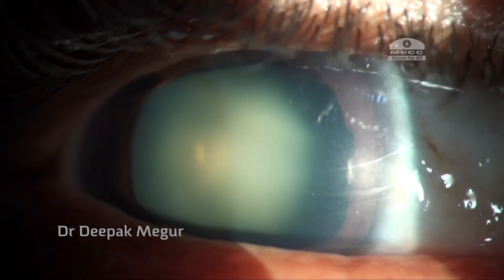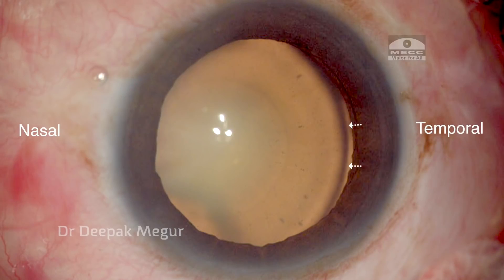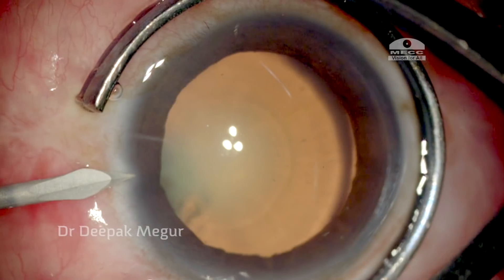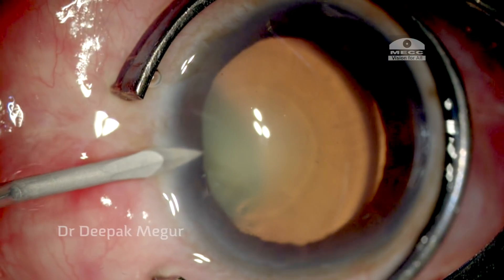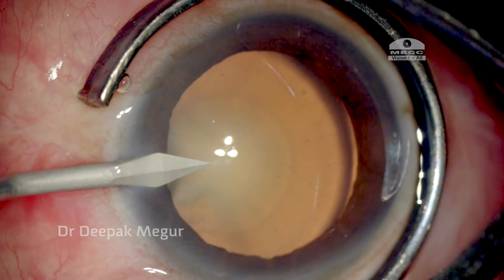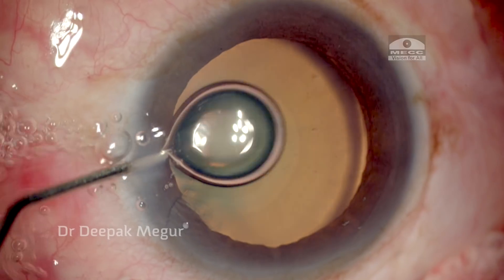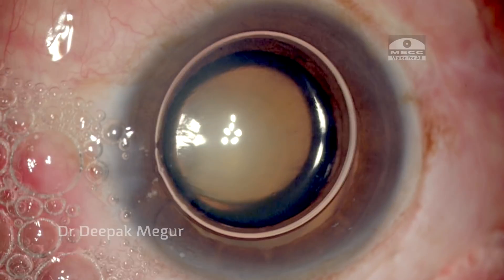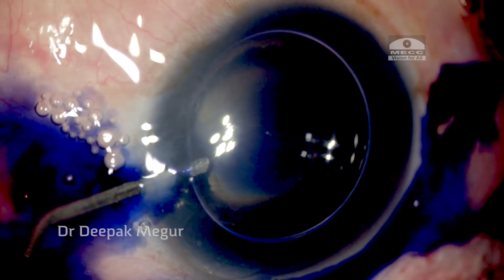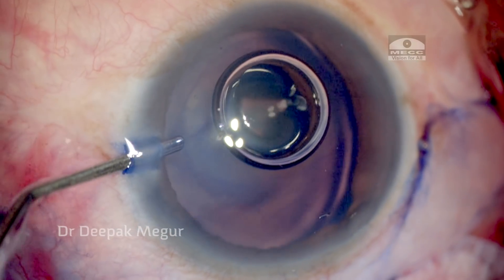This is the area of subluxation — we can see the equator of the lens. We have around three to four clock hours of zonular weakness. I begin by making a side port incision in the nasal quadrant.